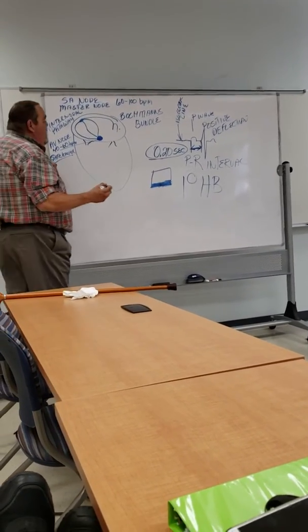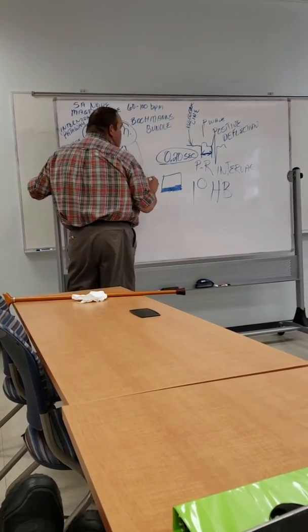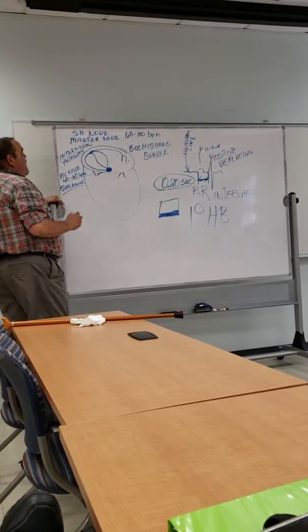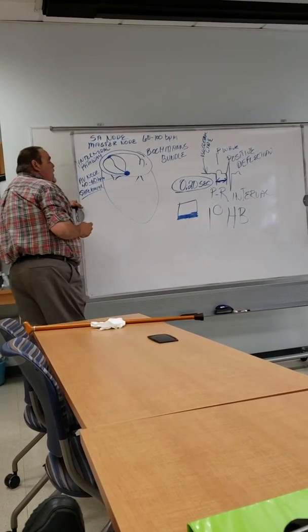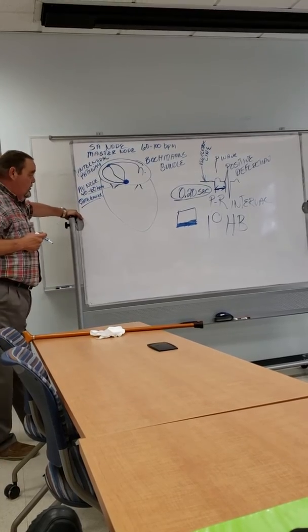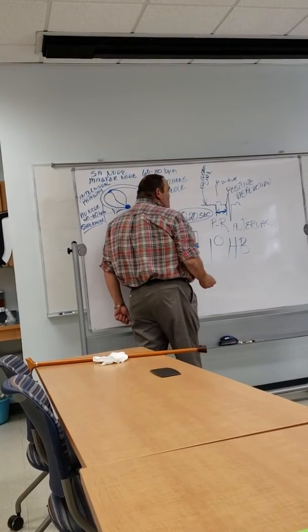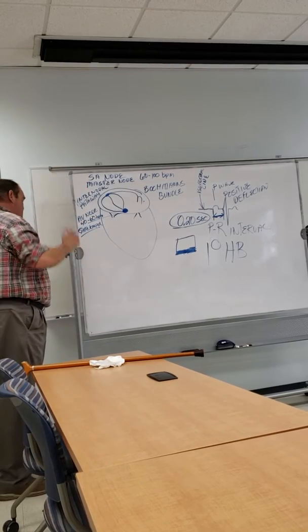Now, we know that this is what causes a first degree heart block: this AV node is holding the impulse too long. Also, if this fails, the AV node will take over at a rate of 40 to 60 beats per minute. Okay? So we'll talk about this in a minute, but that's important to know about your deflection off the isoelectric line, whether it's positive or negative.